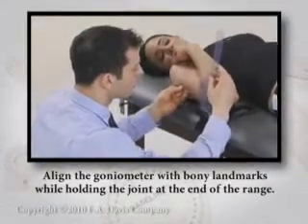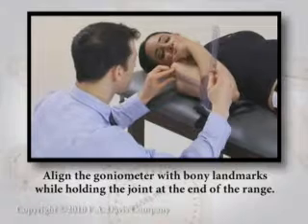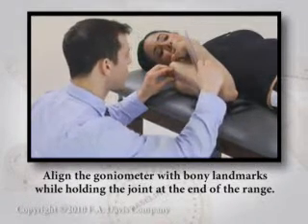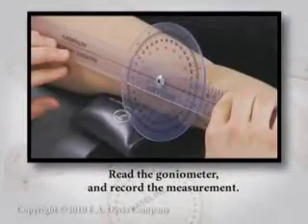Align the goniometer with bony landmarks while holding the joint at the end of the range. Read the goniometer and record the measurement.